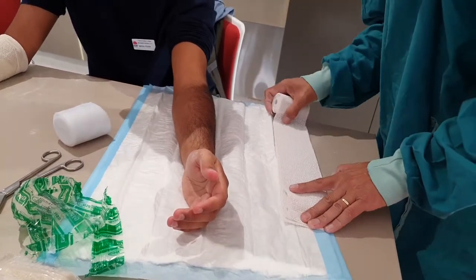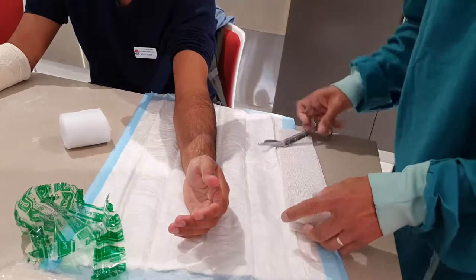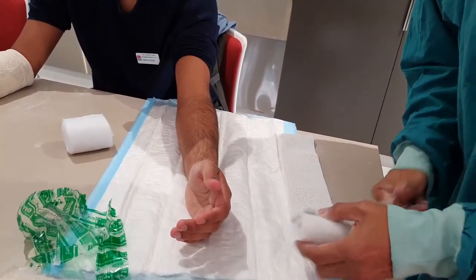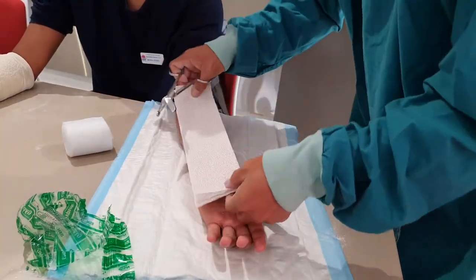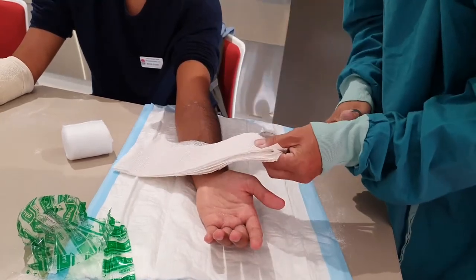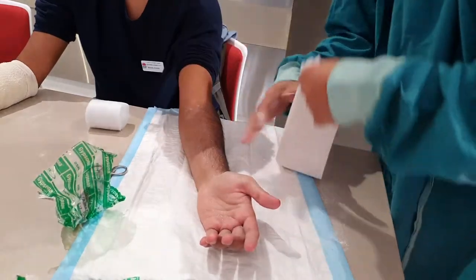I'm going to get my plaster ready and kind of just vibe with his limb. Can you just hold your broken wrist out there please, sir? I'm just going to cut a little divot where his thumb should be and have that ready. Plaster of Paris is actually quite forgiving.